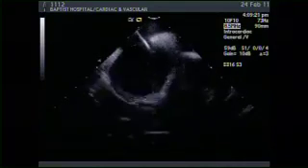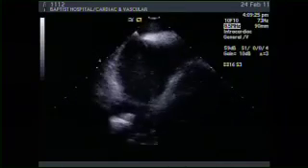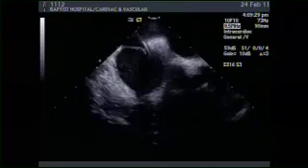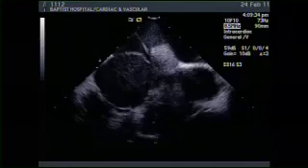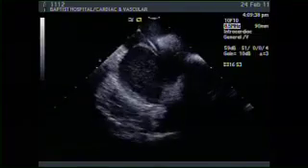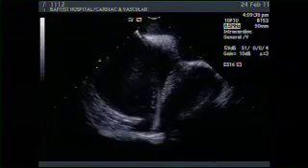So we always stay very careful about where we position our wires, so we don't have any chance of putting the wire in a place that we don't want it to be. So we want to be in the left pulmonary vein. I'm not seeing the veins real clearly. Oh, yeah, I'm right there. Okay, you're good. So anyway, we leave the wire there. Can you show me the fluoro, please? That's nice. We're going to leave the wire there, and we're going to pull it out.